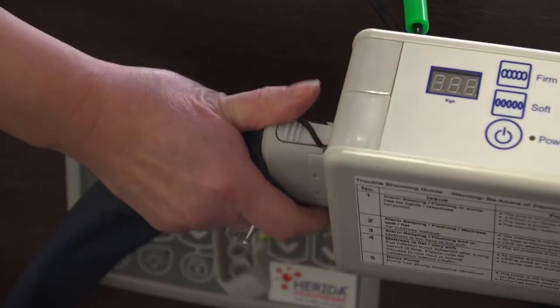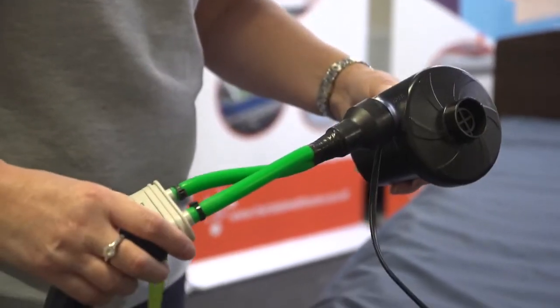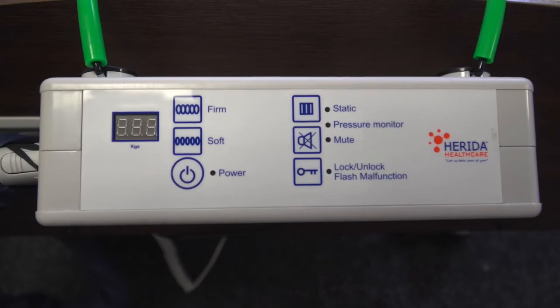Upon installation, an engineer will turn the system on, leaving it to inflate by connecting it to the power switch. However, usually the engineer will use a rapid inflator, bringing the cells up to full capacity in seconds. The Ayrshire operates with a digital pump.